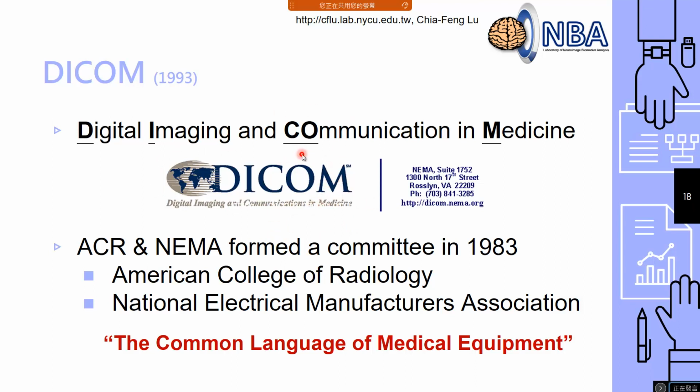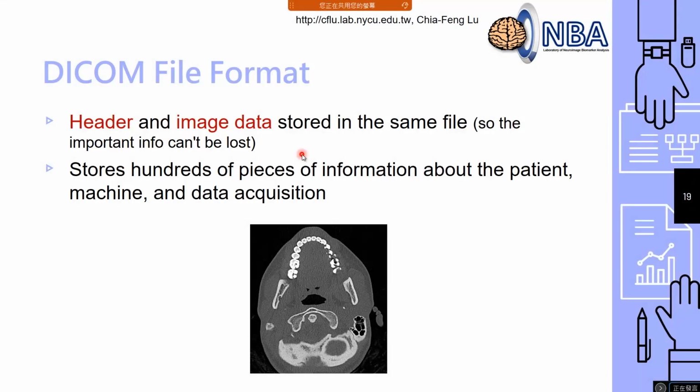So every machine, every manufacturer can create a similar format, okay? And it is very important to know that for a Dicom file, you need to keep in mind that for any medical image, not only the image itself, there's one more thing that is important. That is the patient information. Because we mentioned before, I don't want my imaging generated by me, but assigned to a wrong person. That is a big issue in medical practice, right? So Dicom format is very important.